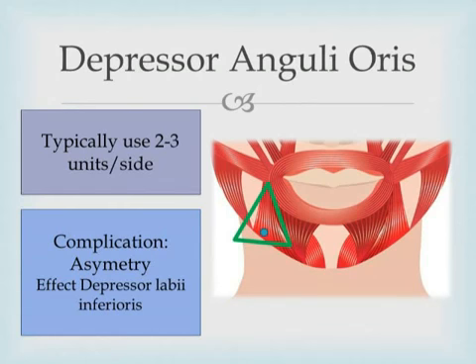Before injecting, palpating the anterior part of the DAO is essential to prevent injecting into the depressor area.